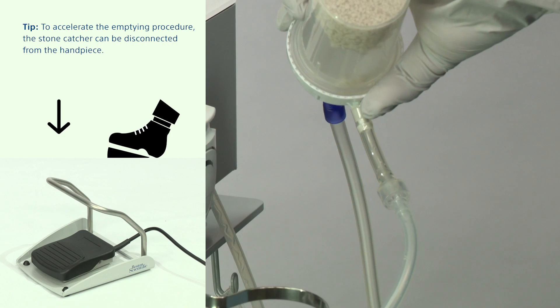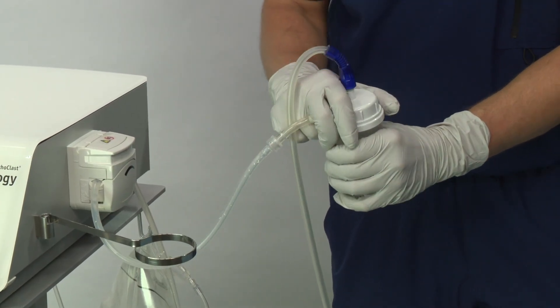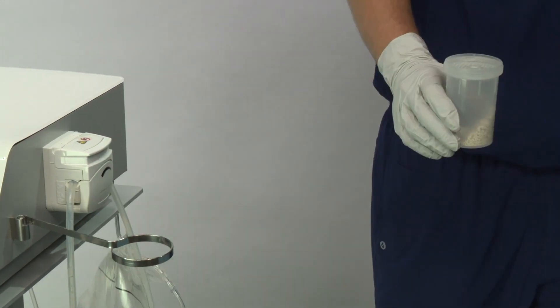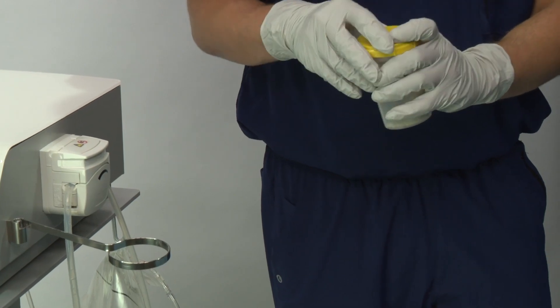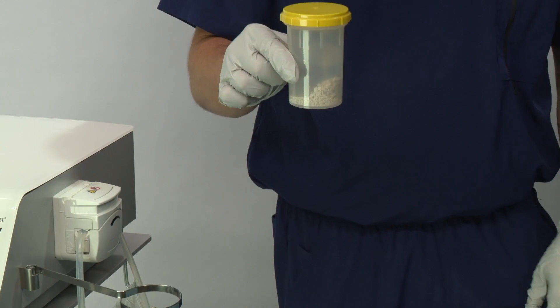Confirm the suction tubes are cleared before proceeding. If the stone fragments are to be kept for analysis, close the receptacle with the yellow transport closing cap supplied with the stone catcher. If the stone fragments are not kept for analysis, dispose of them in accordance with hospital protocol.